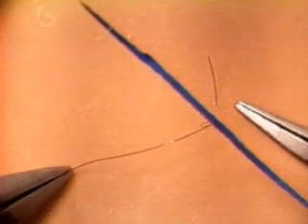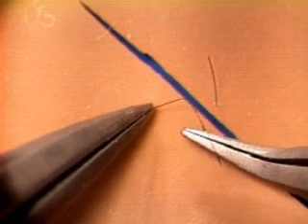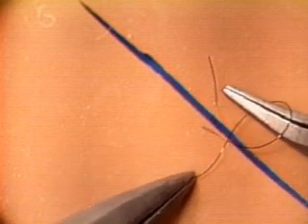Now that we've previewed Act 3 so thoroughly, let's go back to Act 2 and look at making the loop. Bring the left hand forceps toward the side of the knot, and at the same time bring the tip of the right hand forceps down over the loop length of thread. Curl the right hand forceps round the half-formed loop, and the loop is made.